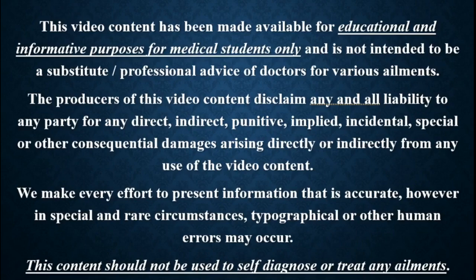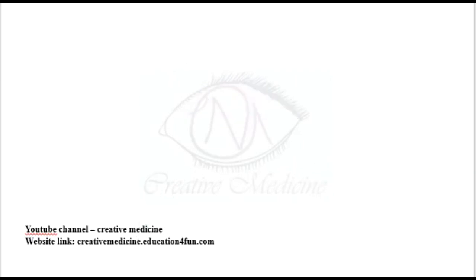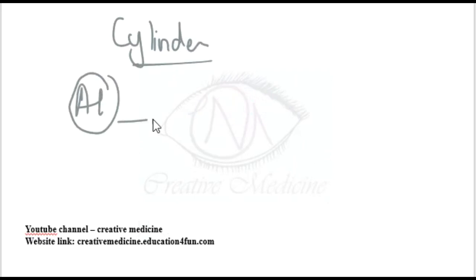In this lecture, we will learn about cylinders. Cylinders are made up of molybdenum steel or aluminium. Aluminium is used in MRI.